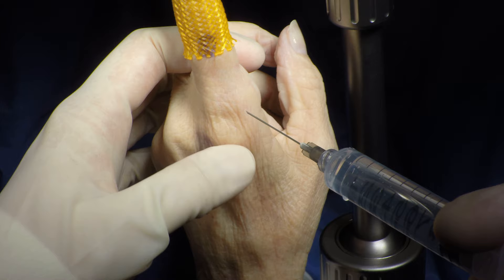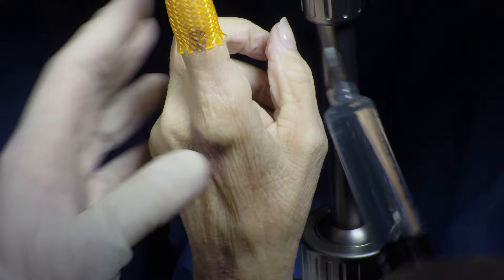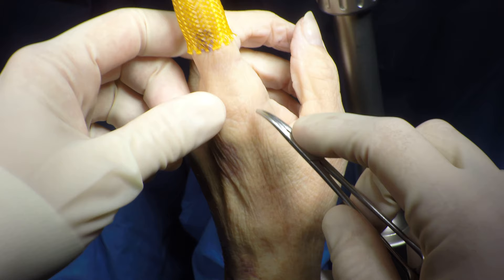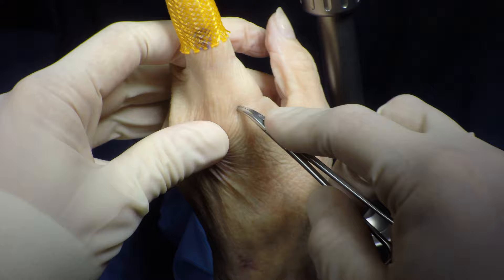The procedure is performed under local anesthetic and some light sedation. The joint is injected with saline. The incision is made by pulling up the skin, which prevents injury to the sagittal bands. Blunt dissection is taken down to the joint.